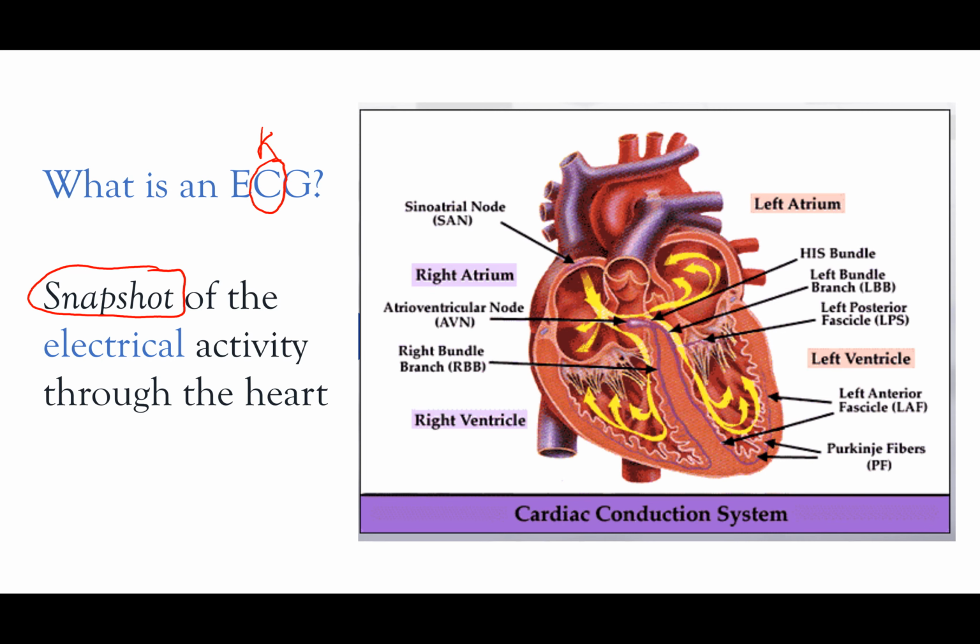You're getting a moment in time. You're just getting a look at the heart for those few seconds that you're taking the ECG. And if the patient isn't having any symptoms, more than likely that ECG is going to look normal, unless there was some permanent damage done or some other clues that you might find. But generally speaking, your ECG is probably going to look fairly normal if there's no symptoms. So it's just giving you a picture in time.